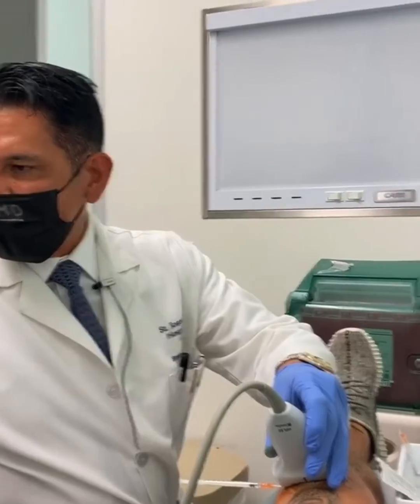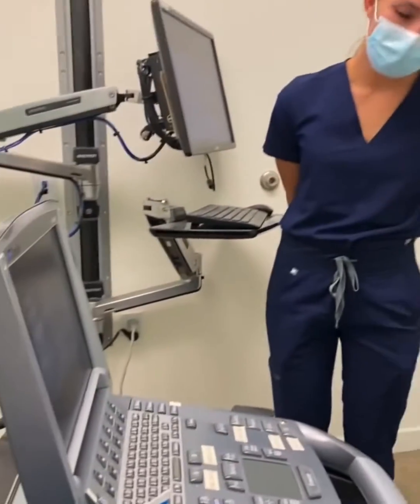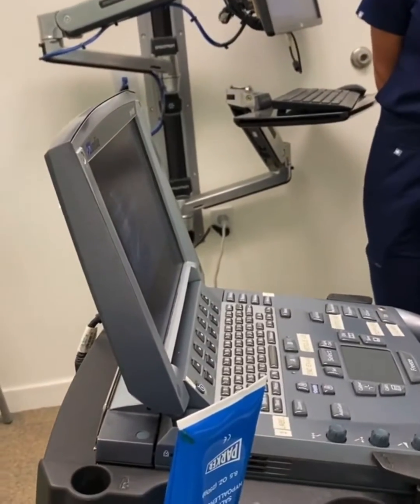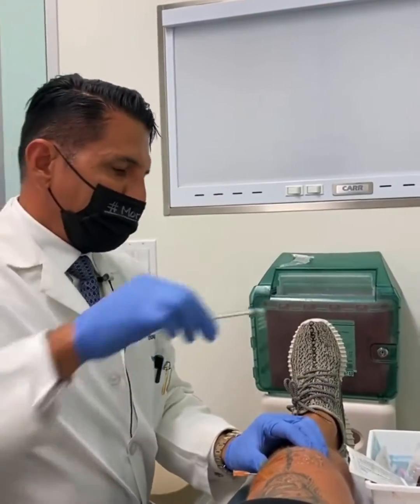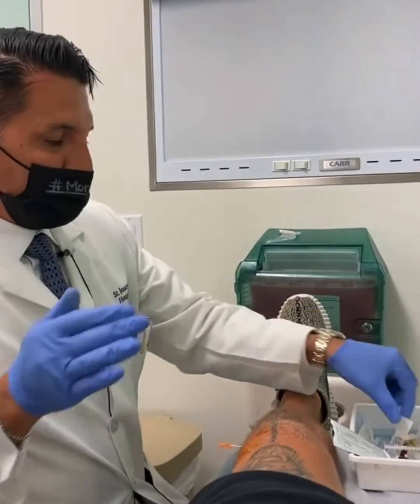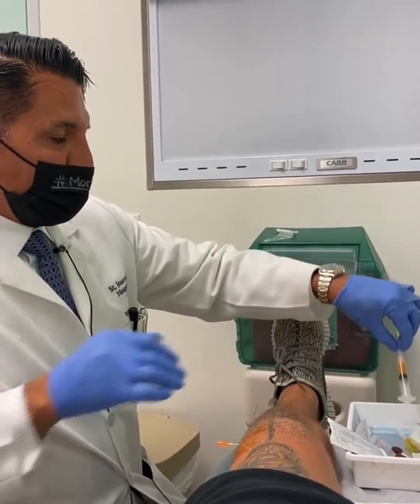So then we use the ultrasound to make sure that we're in. There it is. Lidocaine went right in. Okay, lidocaine — after a little bit of repositioning, okay?